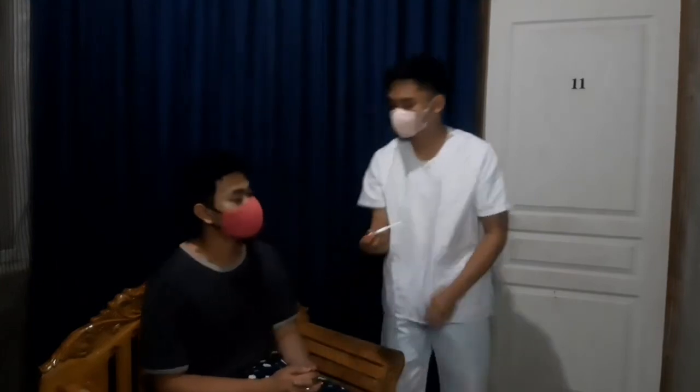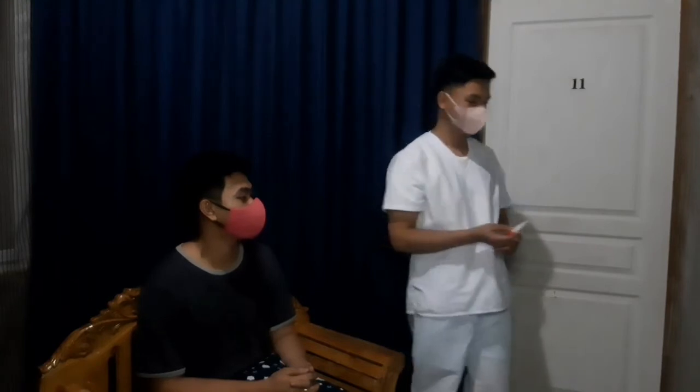Read the temperature and show it to the patient. And now, it's time to clean the thermometer again. Start from the bottom to top. Clean the thermometer in a circular motion.